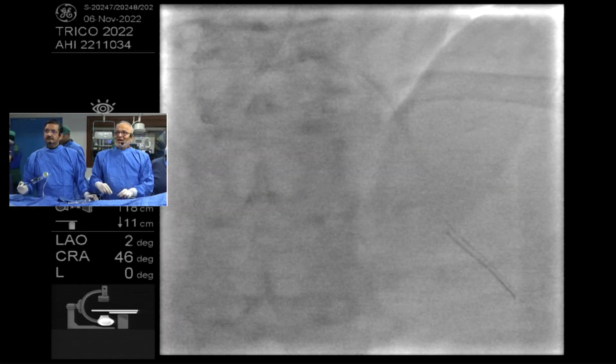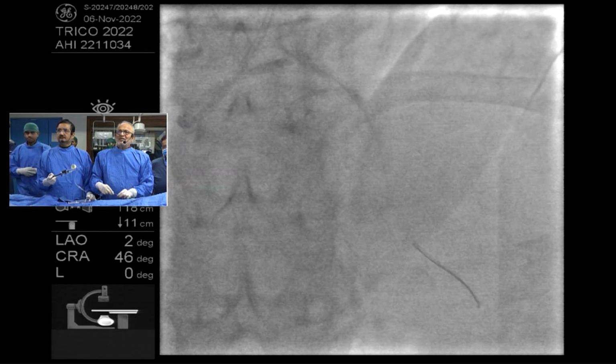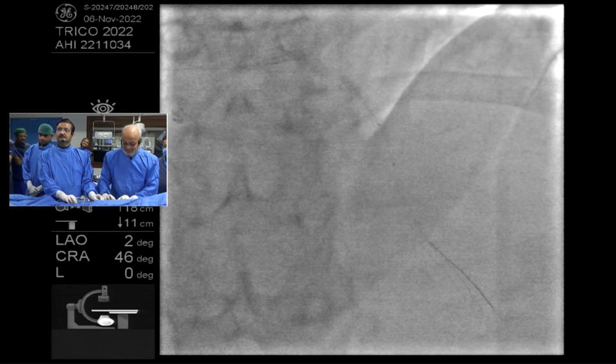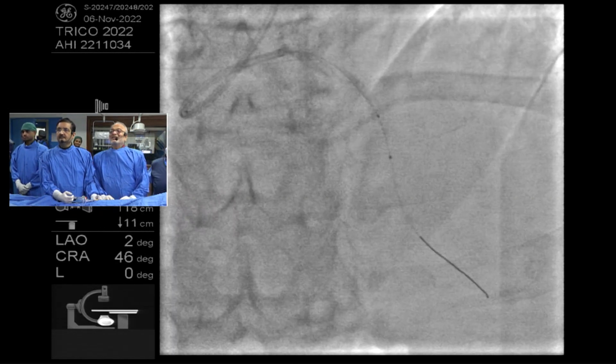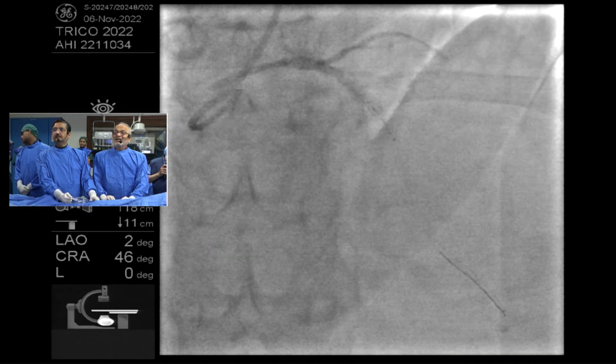But don't you guys realize that without this imaging, how much disservice we have done to our patients in the past? That is true. They will survive though. Yeah, we did the best we could anyway, right? Okay, fine.